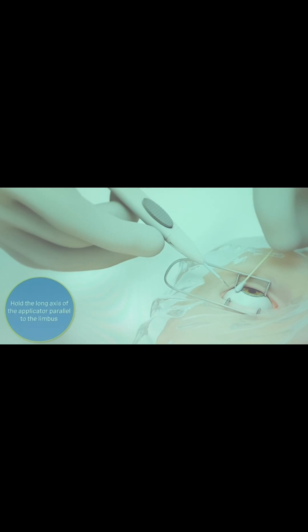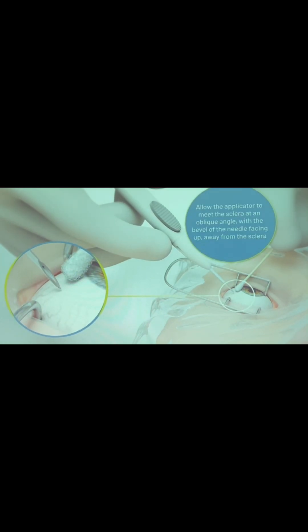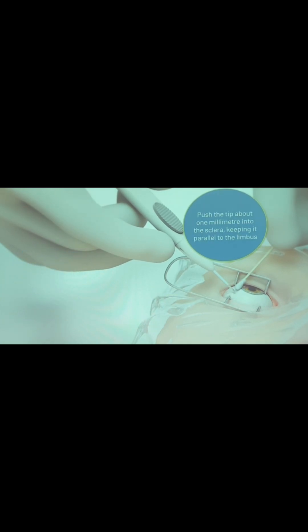Hold the long axis of the applicator parallel to the limbus. Allow the applicator to meet the sclera at an oblique angle with the bevel of the needle facing up, away from the sclera. Push the tip about one millimetre into the sclera, keeping it parallel to the limbus.